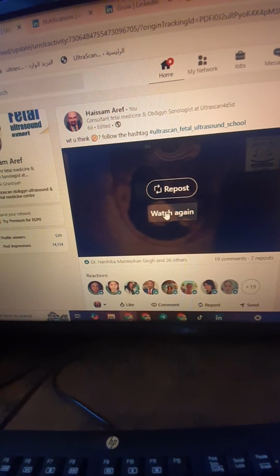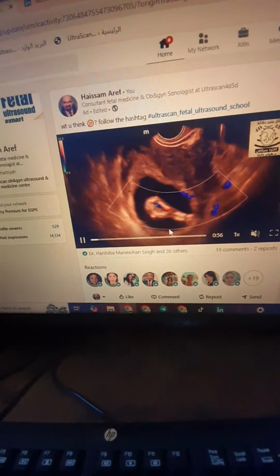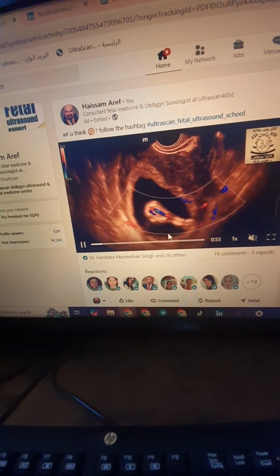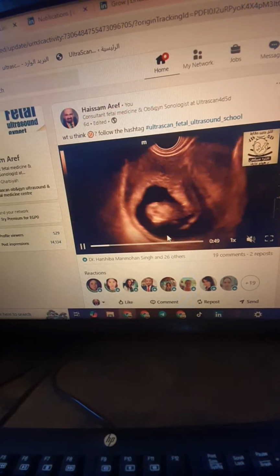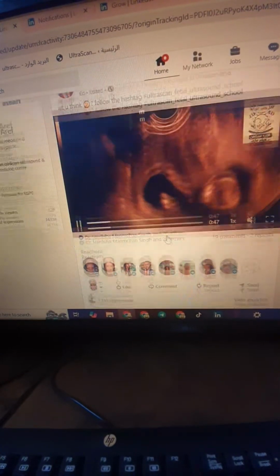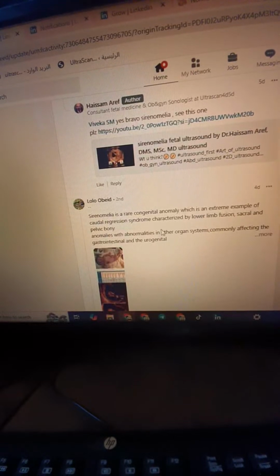Today we will see multiple fascinating cases, like we do every week. And so, our first case for this week will be a lovely case of sirenomelia. We do have here a wonderful case, and actually, all the comments were about sirenomelia.